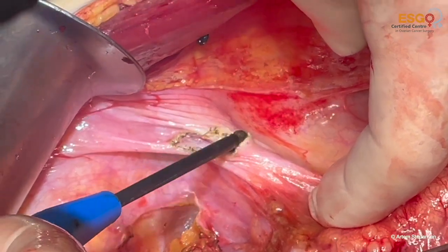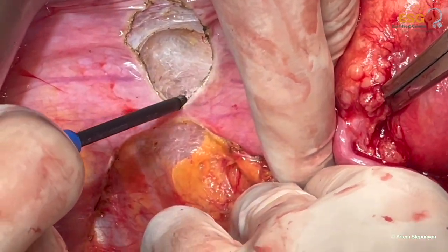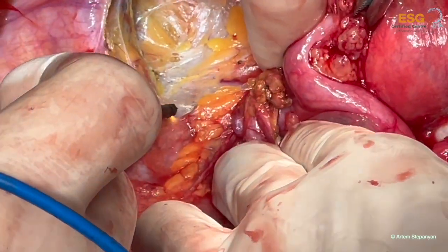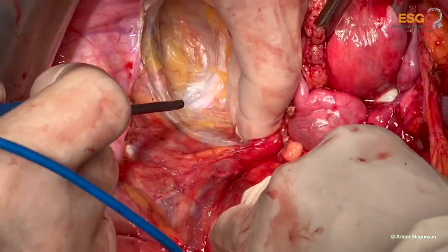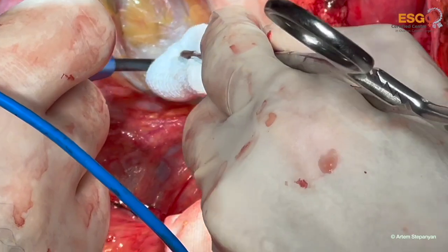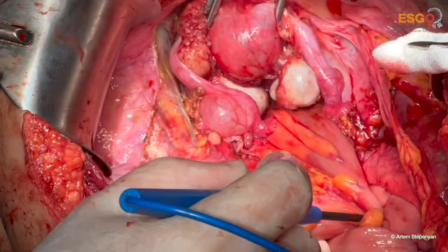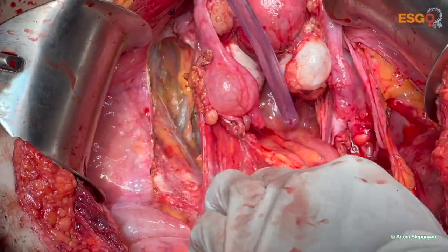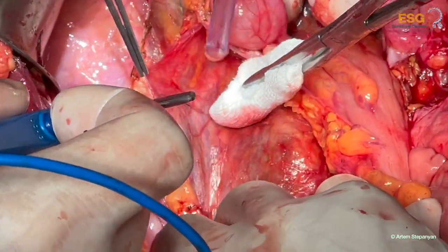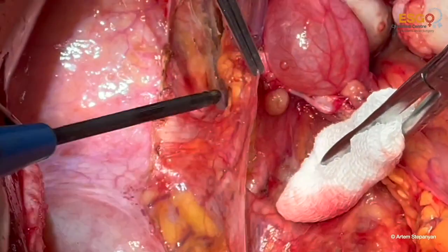Now I'm cutting the round ligaments of the uterus. Like the liver, the uterus also has round ligaments. Now I'm seeking structures like internal iliac artery, external iliac artery and vein, gonadic vessels, ovarian vessels.